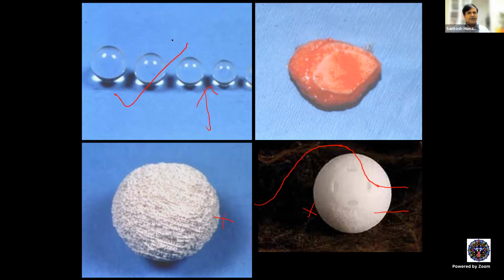Second is that calculation of the dose of radiation is very precise when you use a compact implant. The third reason is that if it is a child and you have done enucleation at the age of 9 months and you have put an implant of 16 millimeter size, the child will grow into an adult and that particular implant volume may not be sufficient for that adult. You might want to replace or exchange an implant. You cannot do that if you have put an integrated implant.